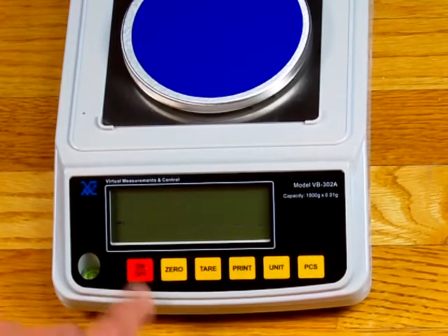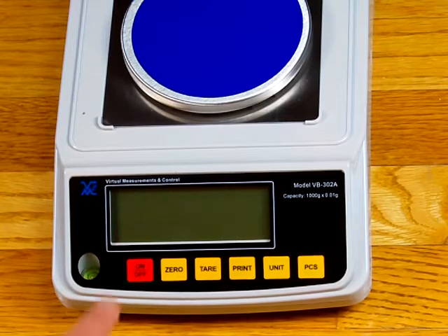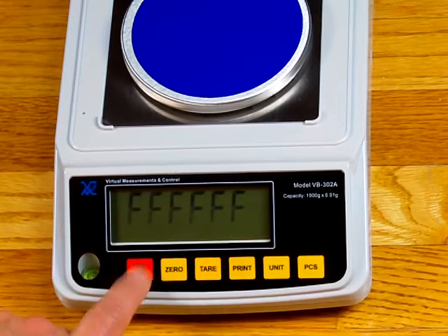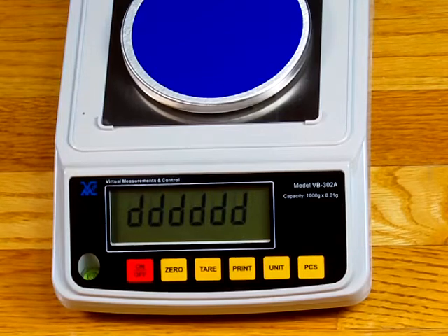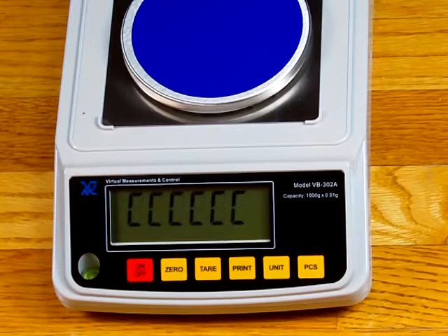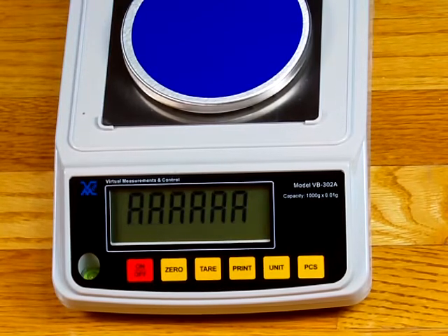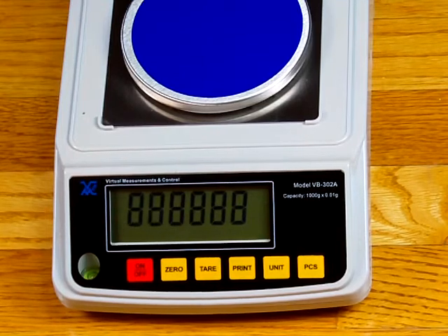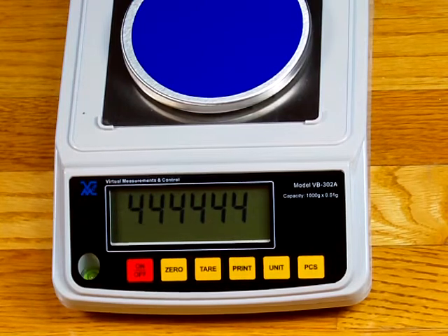And so to do a 5-point calibration, this is simply done by, again, turning on the scale. And this time, instead of pressing just the 0 key, we're going to press the 0 and the unit key together at the same time. And this is going to enable us to do a 5-point calibration.